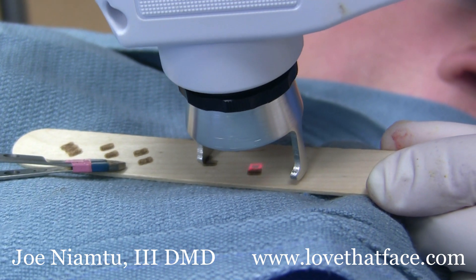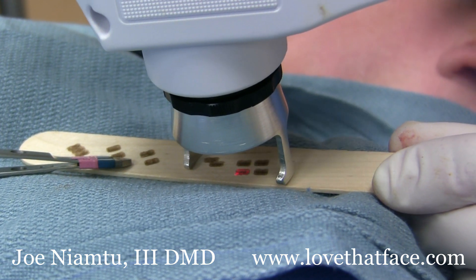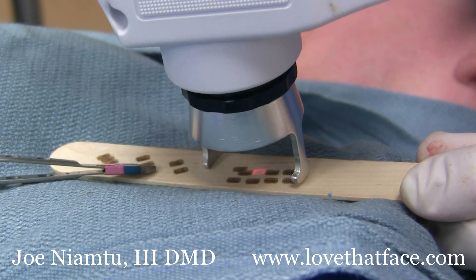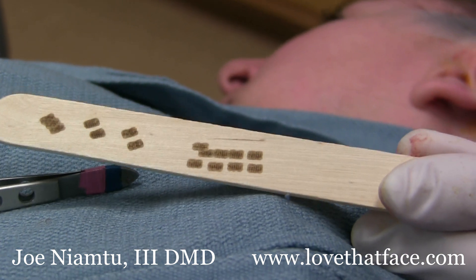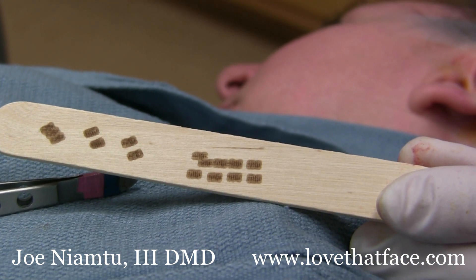So what we're going to do is laser the base of this keloid now with the Elman Cortex laser. We're going to be at about four milliseconds with about an 80% overlap, and this will just help us eradicate the base of the keloid.